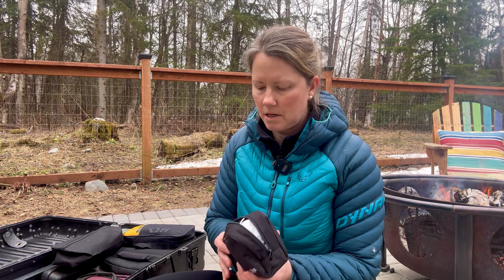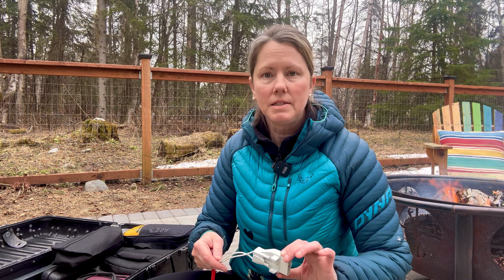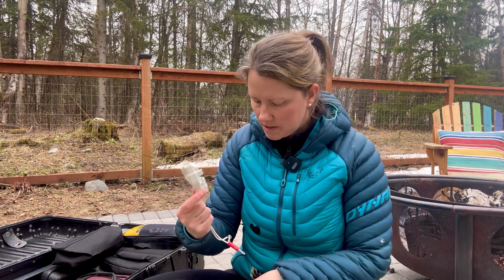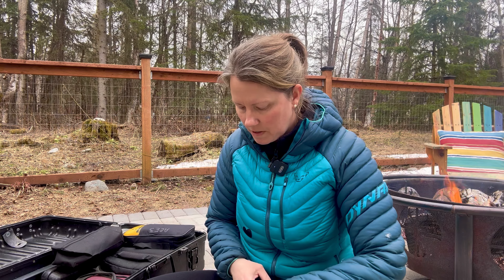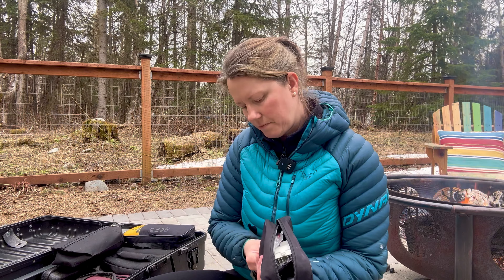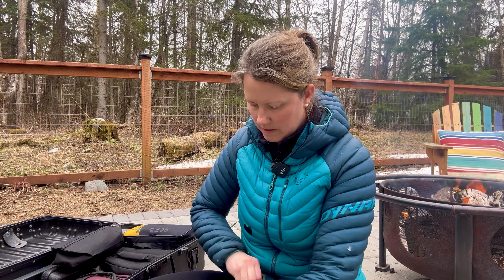This is a little bag that has different connectors for my defib analyzer. I carry different connector types because I'm dealing with different models and manufacturers, so I've got to carry this bag of goodies.